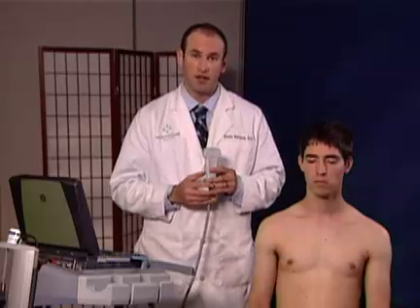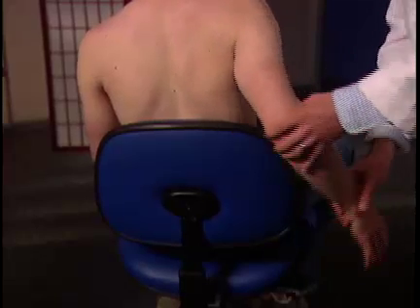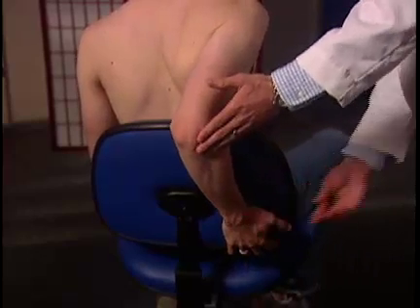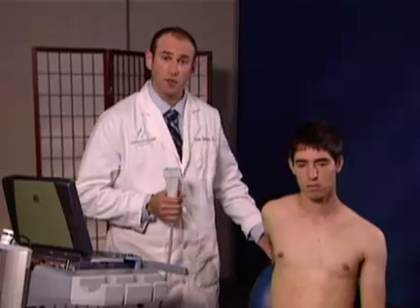To make this examination as time efficient as possible, I have the patient take their right arm and slowly put it back behind their back pocket while keeping their elbow inward. This is termed the modified CRAS technique. What this does is free up the supraspinatus so it's not obscured and I can clearly visualize the tendon efficiently.